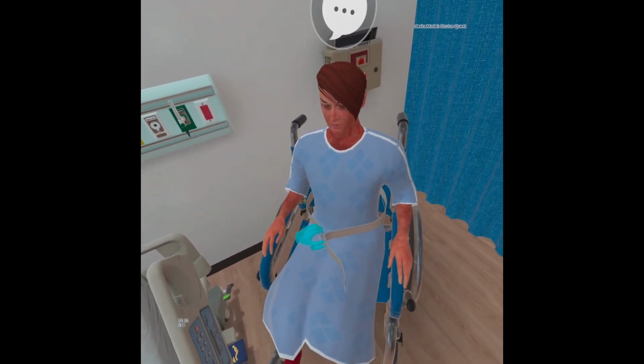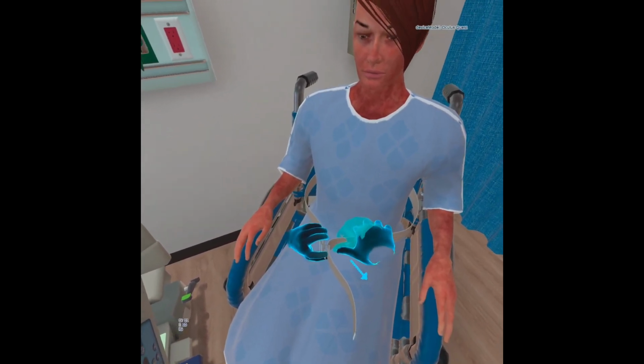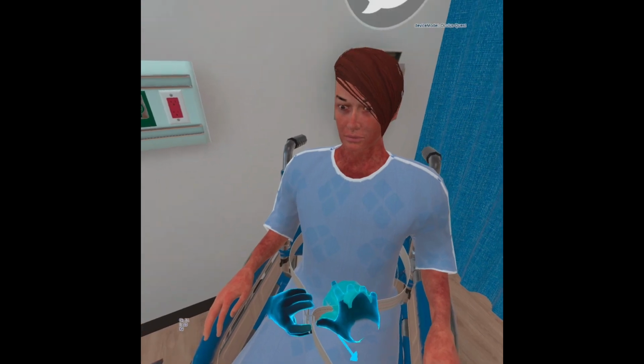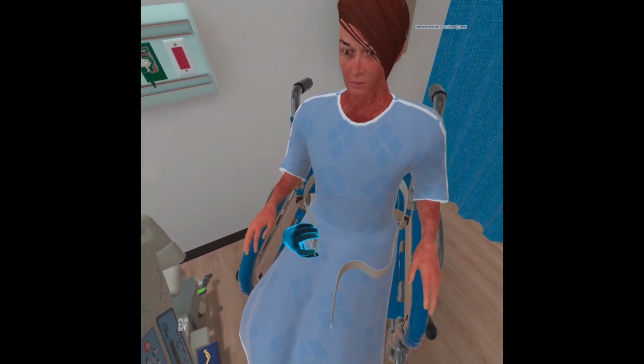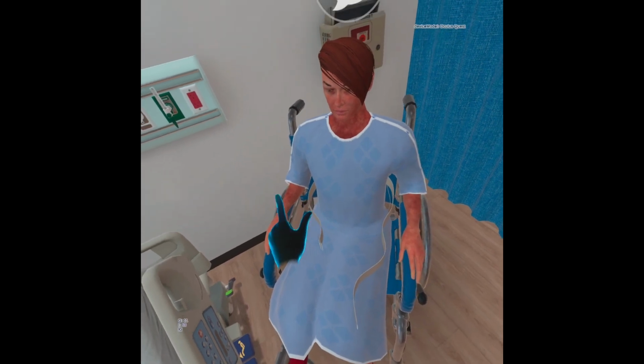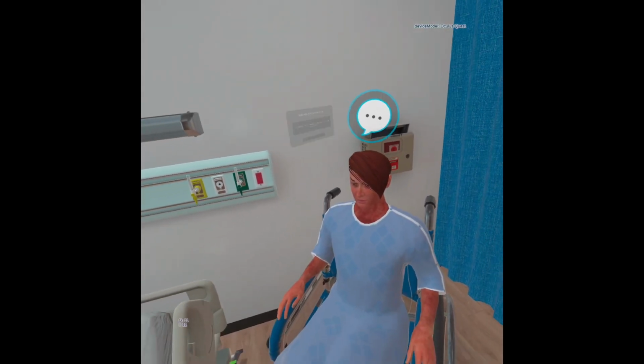Stabilize the buckle with your left hand. And use your free hand to pull the belt strap away from the tooth side to remove it. I'll take that and put it away while you check if Riley wants a blanket.